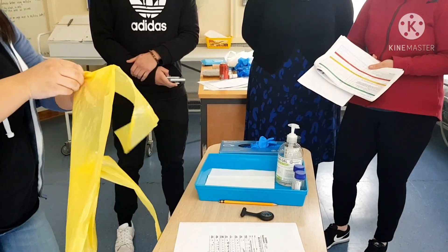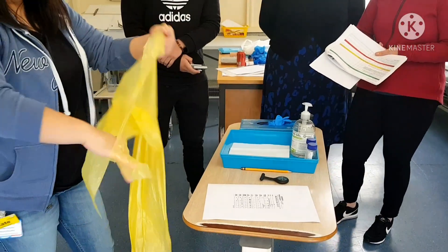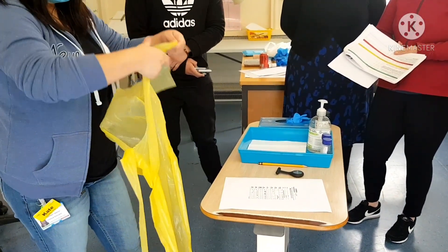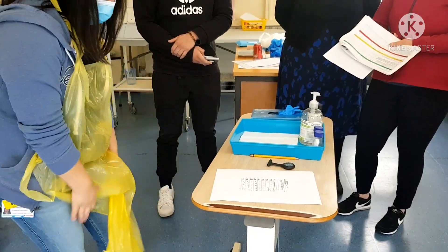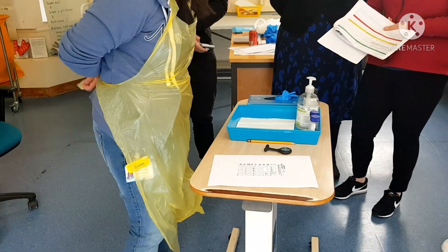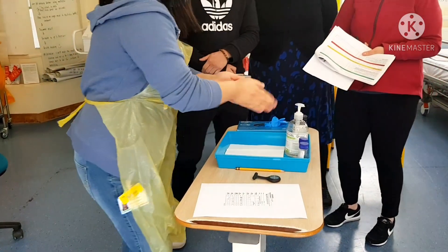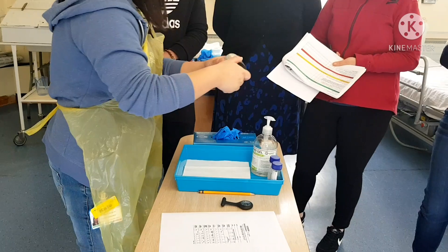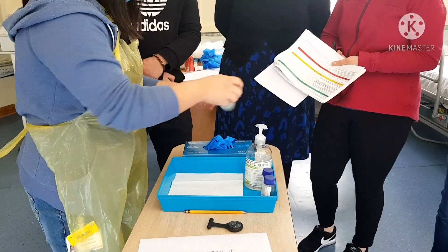Mr. Assessor, can I just confirm as well that my tray no longer needs cleaning? Yes, the tray no longer needs cleaning. Thank you so much. I'm going to wear an apron, Mr. Assessor, because I'm handling urine. The urine dipstick is in date, and I'm happy to use it.